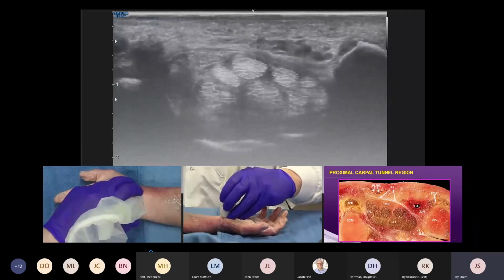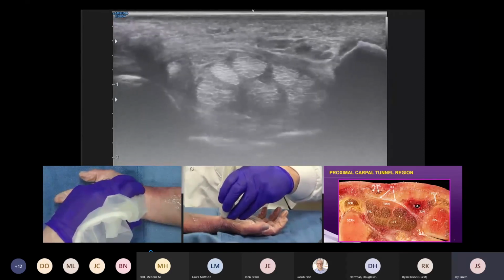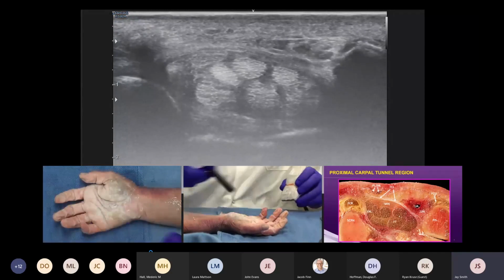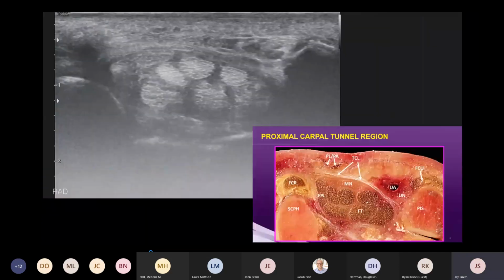We've heard it before at different times for these sessions, and I'm going to freeze this screen. And what we have on the screen is, we'll go to the double now. Yep, 2. So we have the ultrasound image and then a correlative cross-sectional image. So let's look at the anatomy, because everything on your protocol is actually right here with the exception of the radial artery.